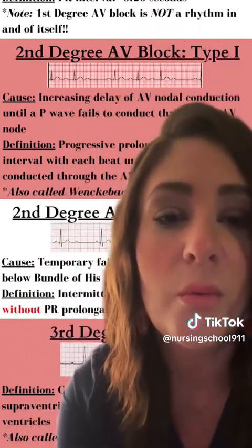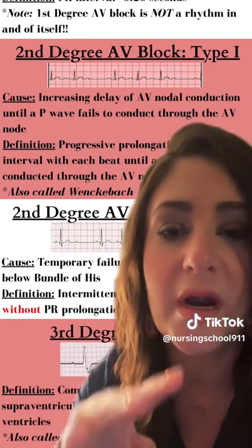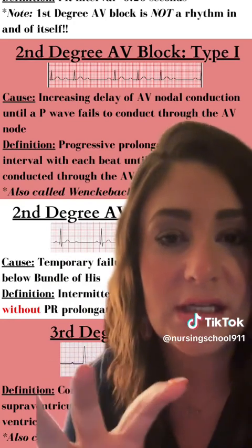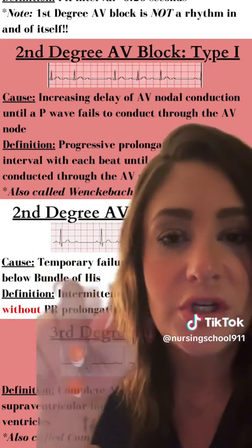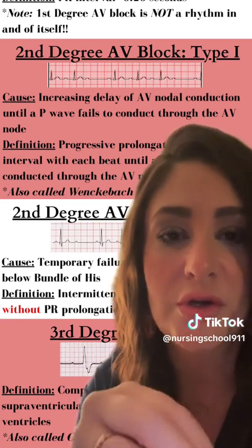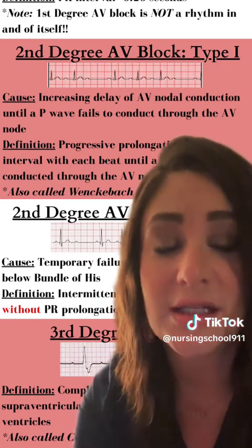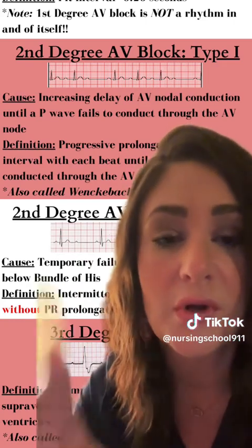And then we're moving down now to talking about the second degree, and this is where confusion sets in, I feel like, differentiating second degree type 1 from second degree type 2. So a second degree AV block type 1 is a rhythm by itself, okay?